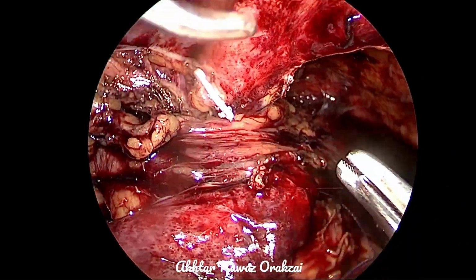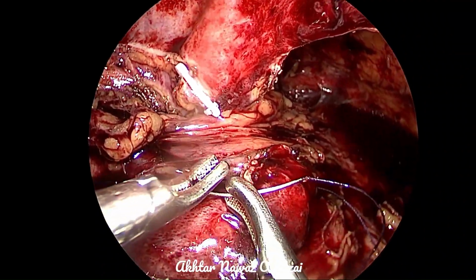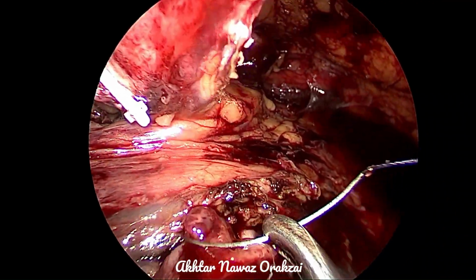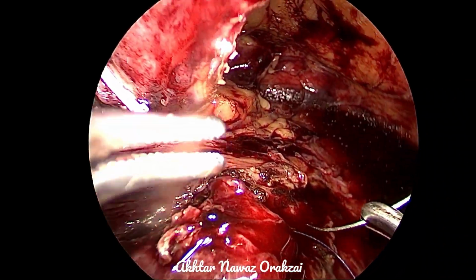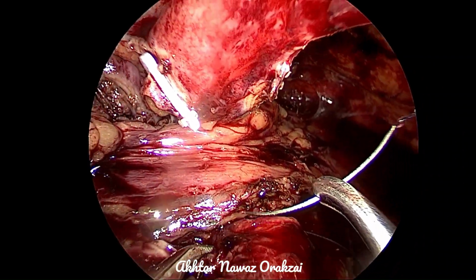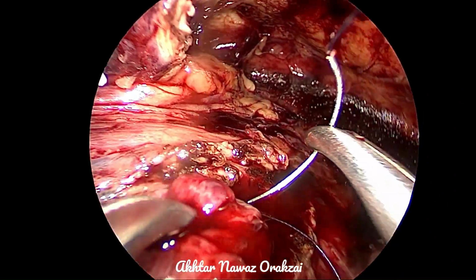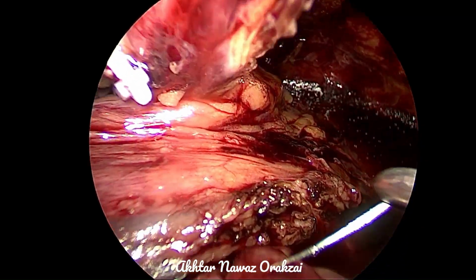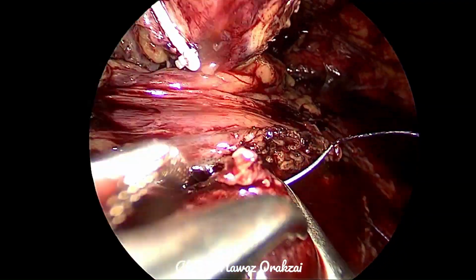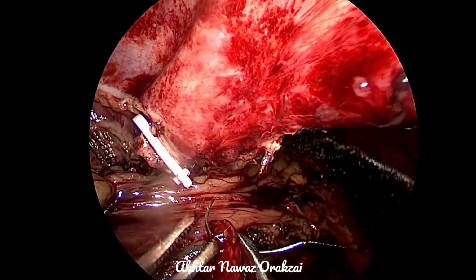So once this wall is done, then we will place a stent, and then we will perform continuous suturing of the other side. Care must be taken not to close the lumen, and sutures should be taken under vision. Yes, of course, first few stitches are difficult because the lumen of the ureter is small.